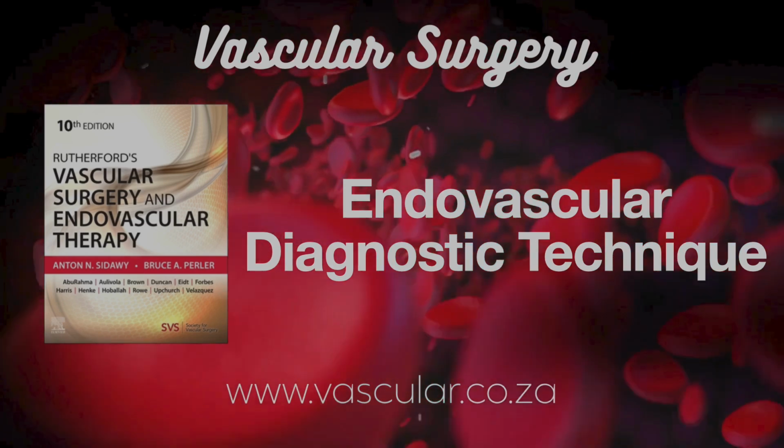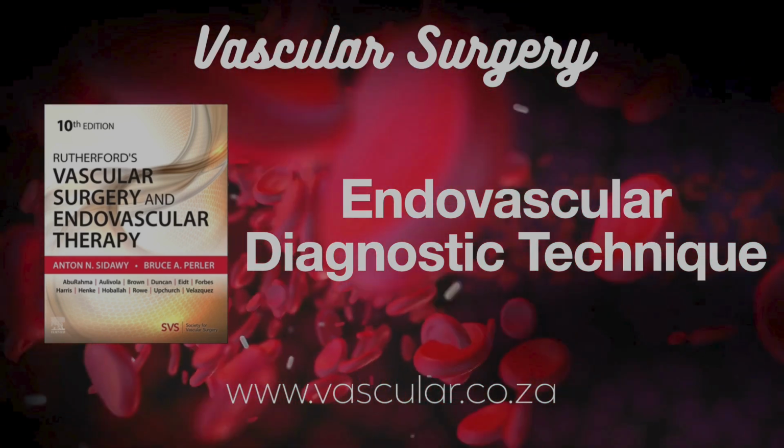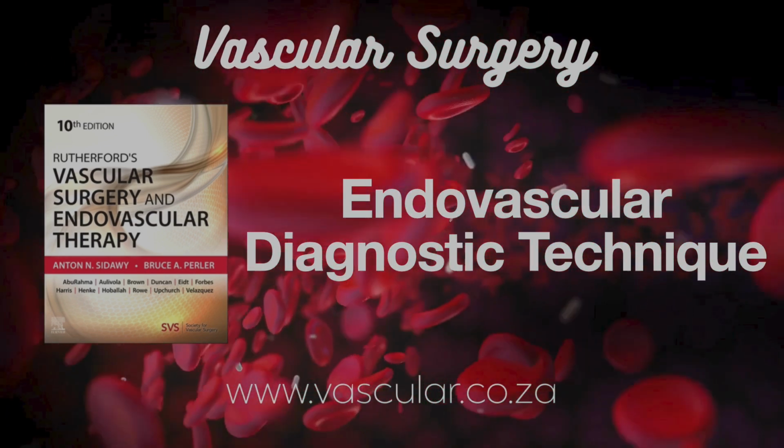Is it harder with different arch types? Yes, type 2 or 3 arches where branches come off earlier or steeper can be more challenging, might need catheters with more extreme curves. Meticulous wire and catheter handling is paramount throughout to avoid causing a stroke.